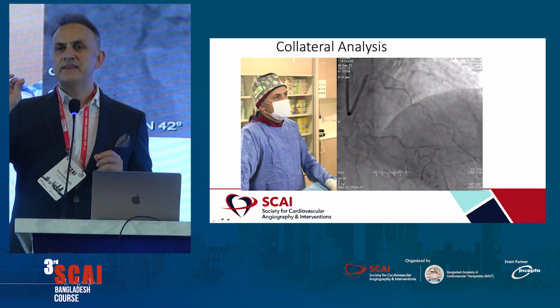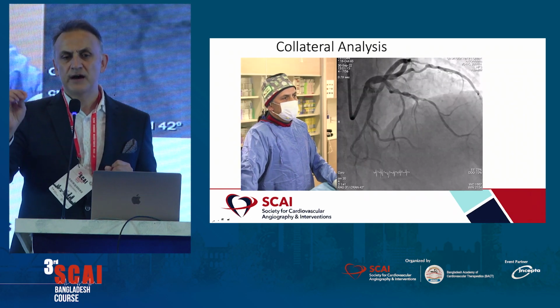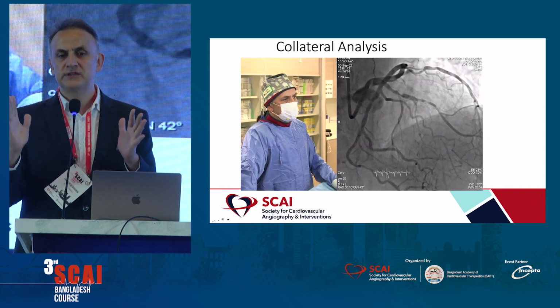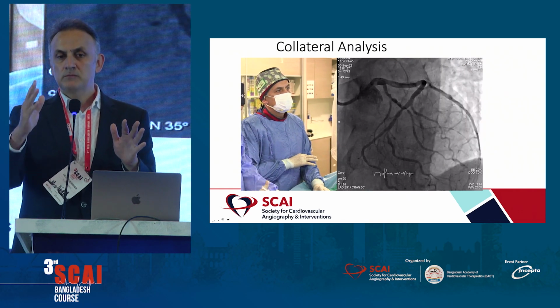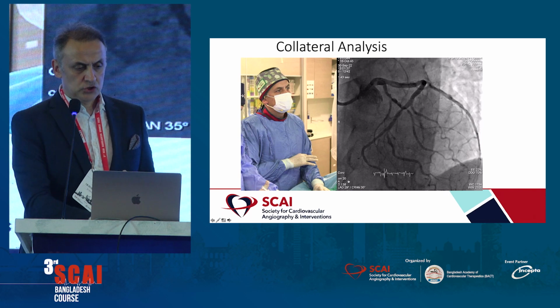So here you see that we have LAD occlusion, right? There is a nice diagonal. After that, we have LAD occlusion. There is a distal filling, very nice filling from somewhere. But I'd like to show you again.